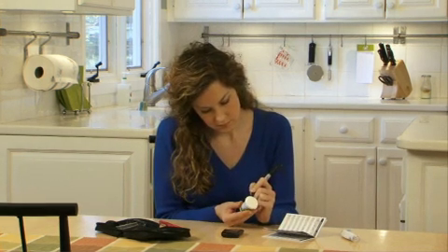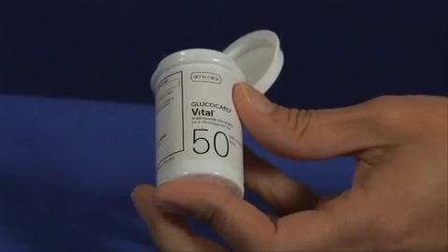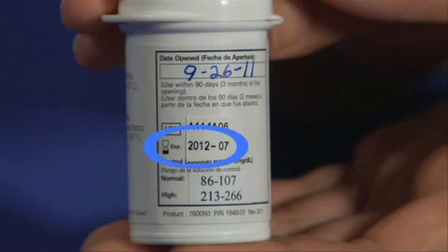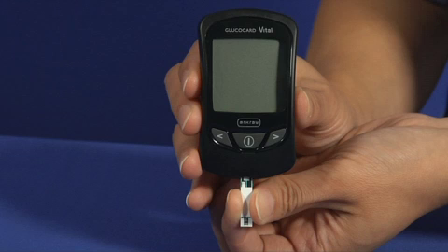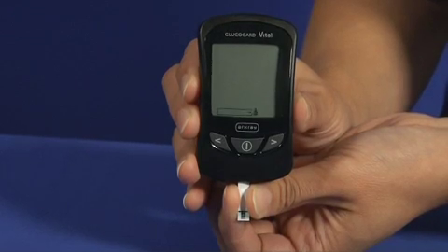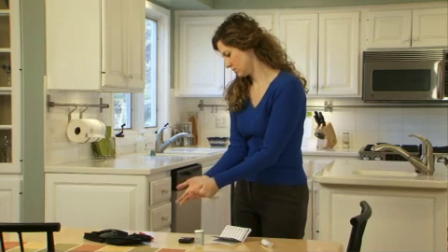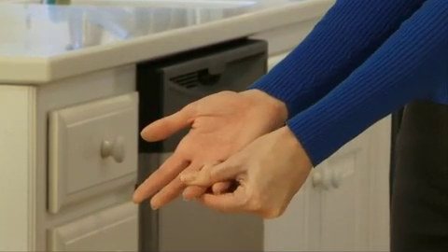When opening a new bottle of test strips, always record the date the bottle was opened on the bottle label. Remove a Glucocard Vital test strip from the bottle and immediately close the cover. Check the expiration date and the date the bottle was first opened — test strips are good for 90 days after first opening. Insert a Glucocard Vital test strip into the meter with the contact bars first and the reaction site facing up. The meter will automatically turn on. Next, obtain a blood sample.